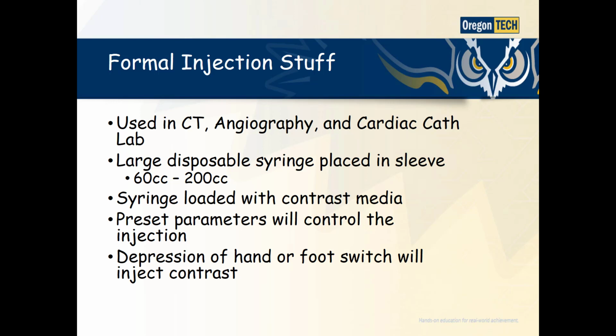It's the preset parameters that will control the injection. In other words, you will see here in just a moment that you're going to set a flow rate, a volume, a pressure, a rate of rise, and that will determine the injection.